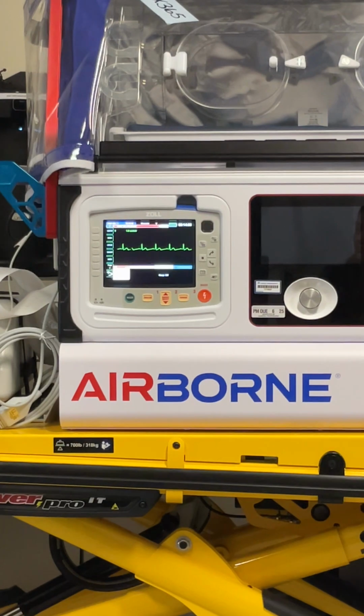So we're going to be required to print this? No, you're not required. You don't have to use the buttons. It's labeled, it'll label it and timestamp it. This will also do your vitals Q15 if you don't want to do pictures. So when you print that report, your vitals every 15 is going to be on there, and when you left.